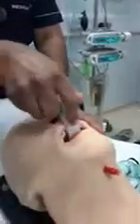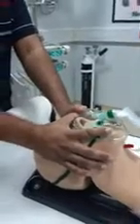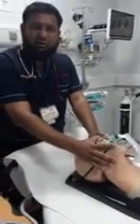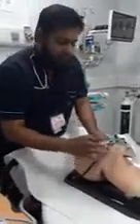Then how do you put it? You put it first backward, like this, and rotate it 180 degrees. And attach the oxygen mask again, and see, is there any noisy breathing still on? Yes, there is noisy breathing still on, and the patient is having a problem with the airway. Anyway, this is one of the options.